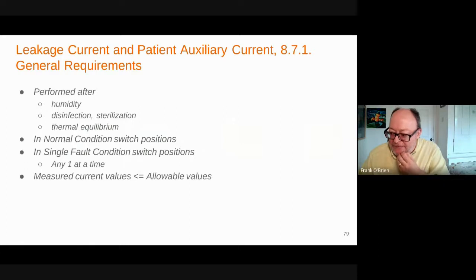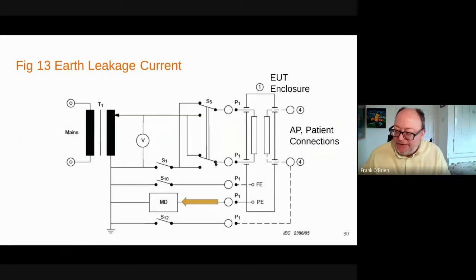So leakage is done after humidity, but also after temperature. And in fact, we do it after, especially accessories that are sterilized. We're doing it after that. One fault at a time, you're checking for your limits.